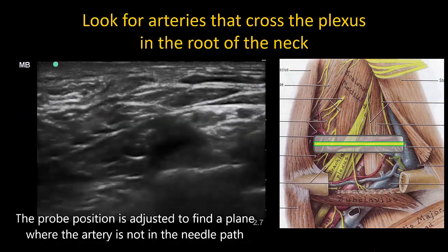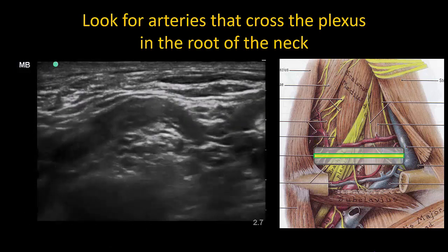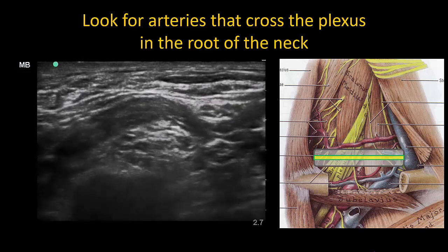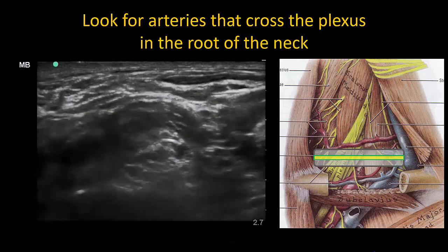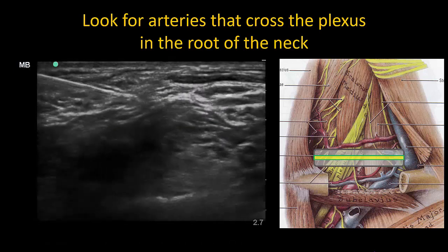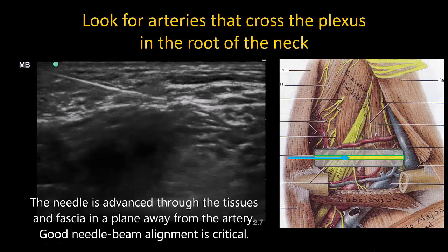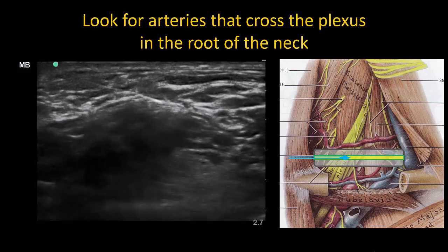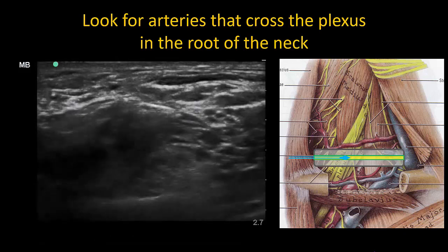It is important to be aware of where these arteries are, particularly if you are struggling to align your needle with the beam during in-plane needle insertion. In this example, we identify the transverse cervical artery, then shift the probe so that the artery is no longer in view and thus not lying in the path of the needle. When inserting the needle, maintain good alignment and needle-tip tracking, remaining aware of whether the artery is more cranial or caudal relative to your probe and needle position.